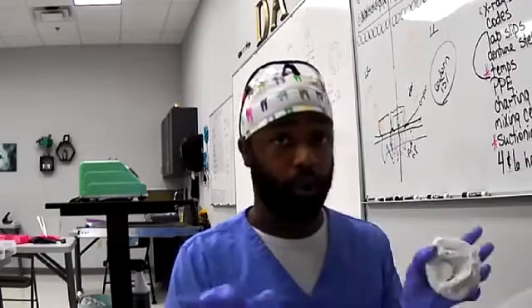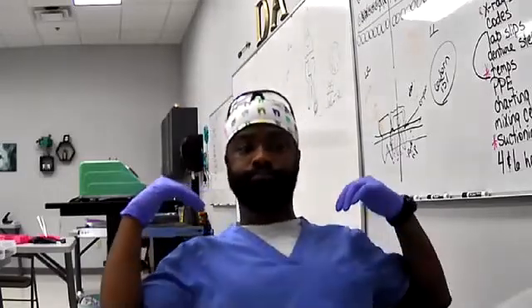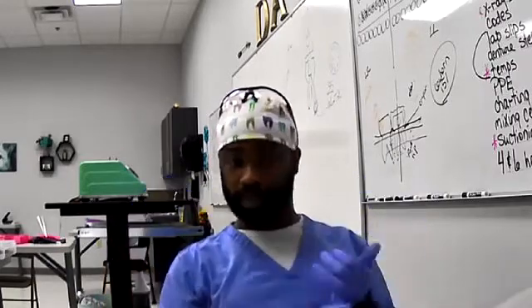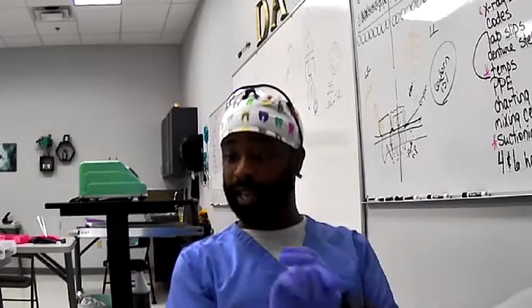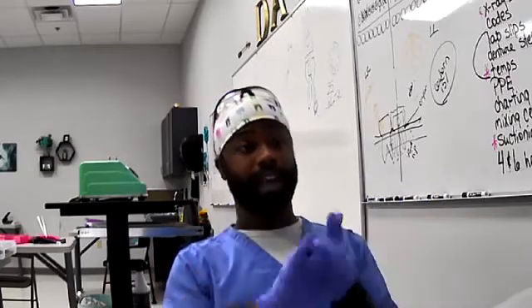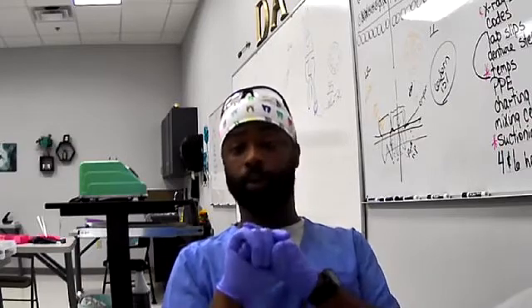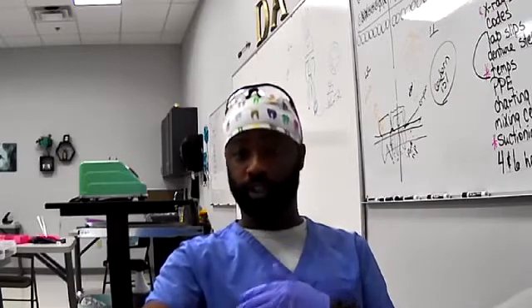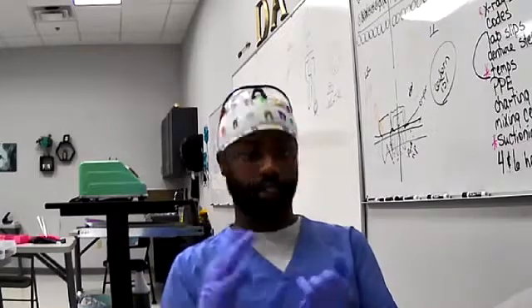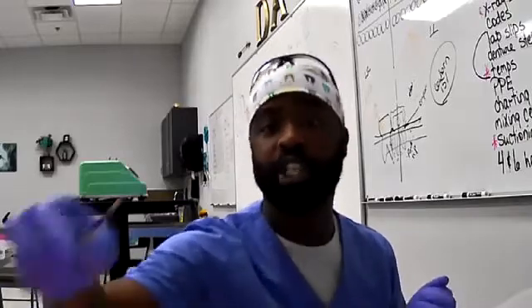Okay, no amalgam whatsoever. So we removed the decay. What else did we do? We put a little dental dam in there. We isolated the tooth with the matrix band, wedged it off. We packed the tooth with the actual material. We shaped the tooth with the cleoid discoid, the Hollenback, the Woodson. Next, you would check the bite.